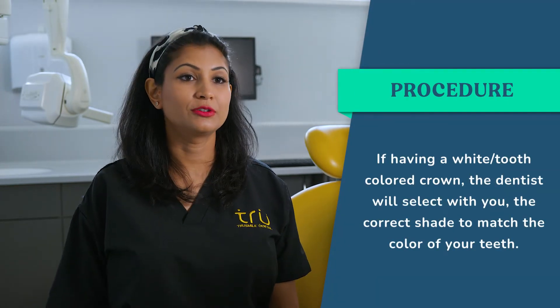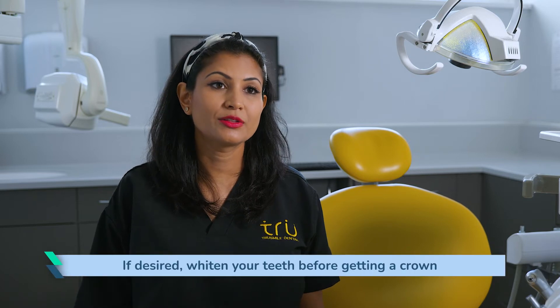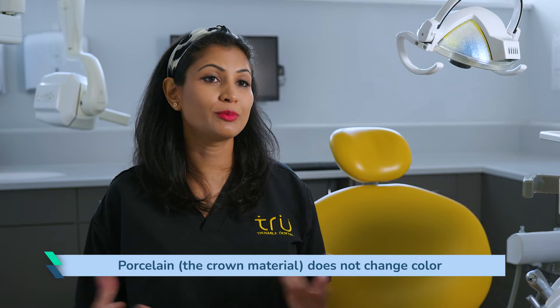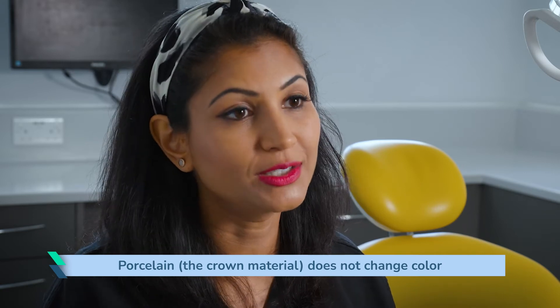Your dentist will take a shade of the crown, which is the colour that your crown is going to be. If it's a metal crown, it will be a gold or silver colour. If it's a tooth-coloured or white crown, there are different shades of white that your dentist can help you choose to make sure they match the rest of your teeth. If you want to whiten your teeth, it's worth doing that before your crown is fitted. Just note that porcelain does not change colour — so although your natural enamel may change colour with whitening, the porcelain will remain stable.